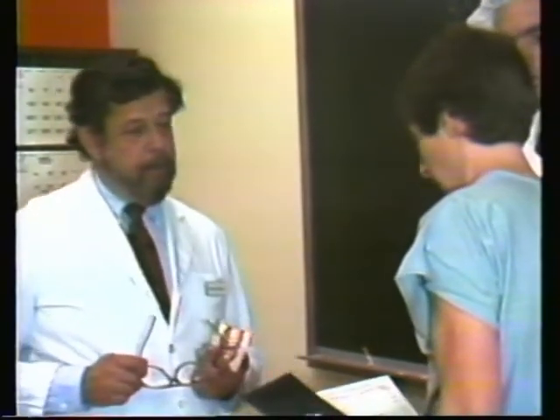Okay. What are you going to do for her? What kind of a procedure are you going to use on her? Well, basically, I'd like to use a number 17 forceps and simply luxate the tooth until it comes out. Okay, you go ahead, but call me if you have any trouble at all. Okay, thanks, doctor.